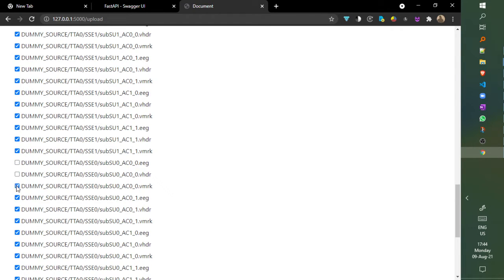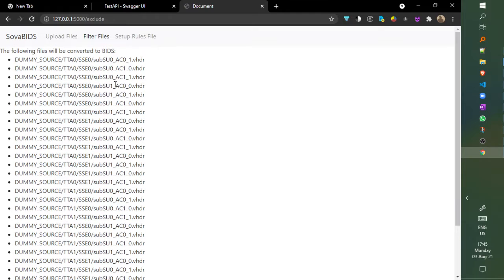So we can skip that EEG record. We just press send. As you notice, the 00000 combination is not here because we excluded it from the conversion.